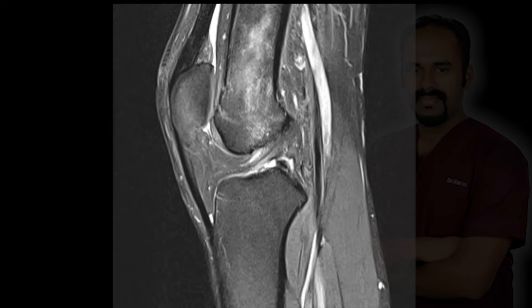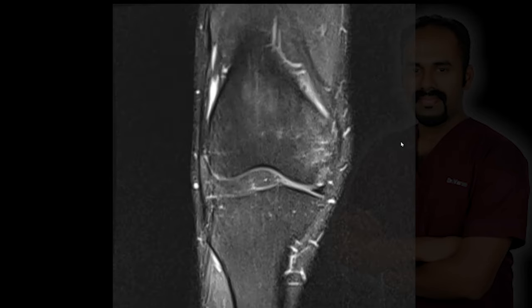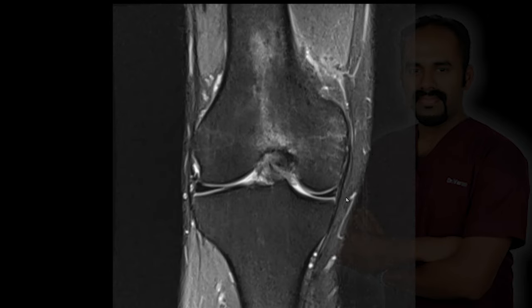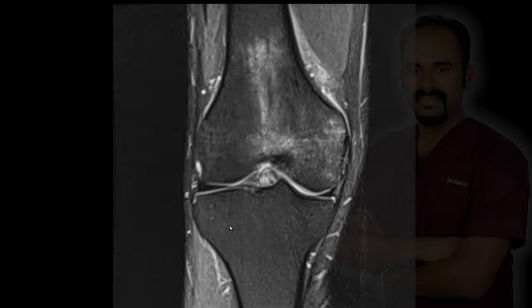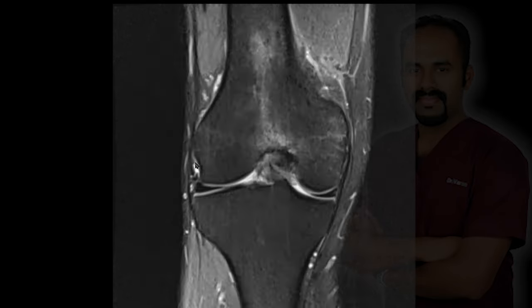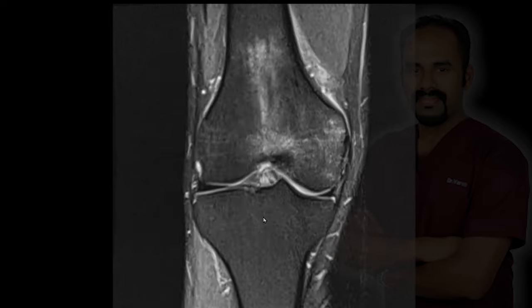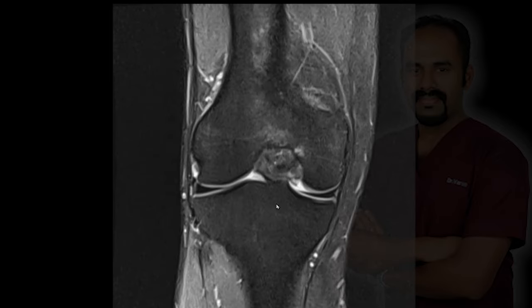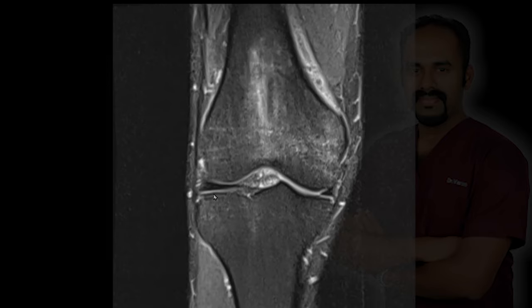Let's have a look at the coronal PD fat-saturated images. Here we can identify the medial collateral ligament, which appears intact, as does the lateral collateral ligament. The articular margins look all right and the cartilage appears to be preserved.